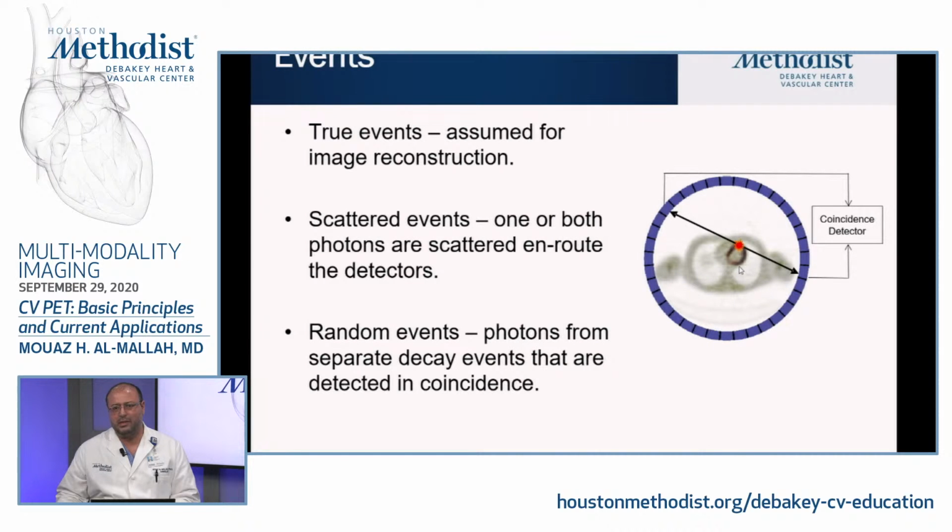The patient is in the middle, you inject the radiotracer, it emits the photons, and we'll talk about the two separate photons, but then you now have a full ring around the patient. So it's not only the front; in whichever way these photons go, there are detectors 360 degrees around the patient, and now we get them.